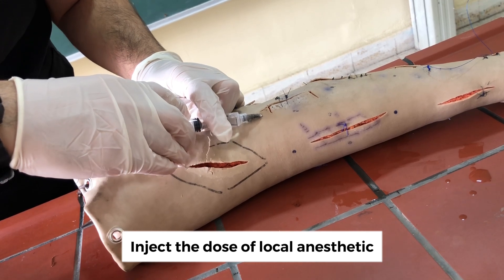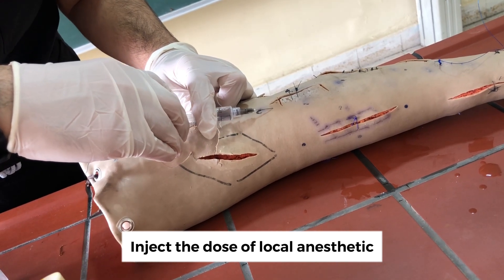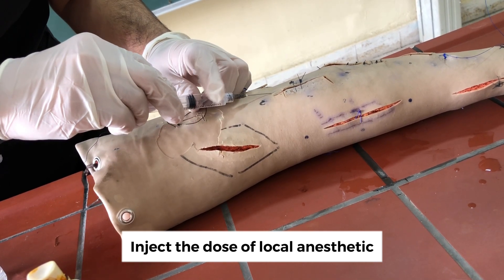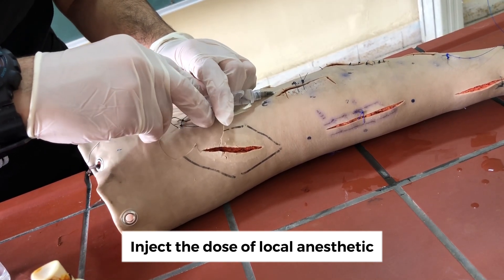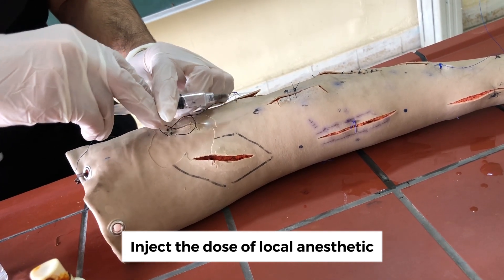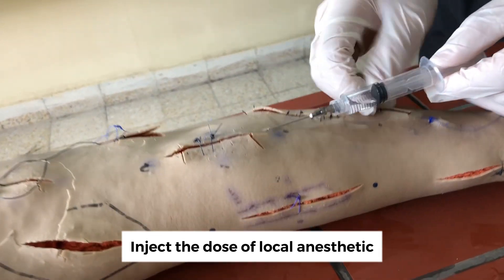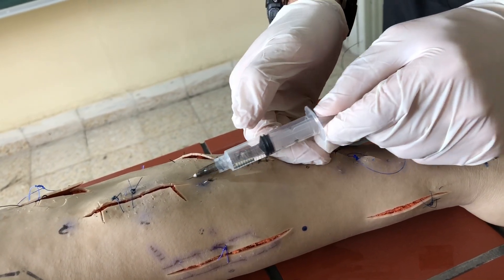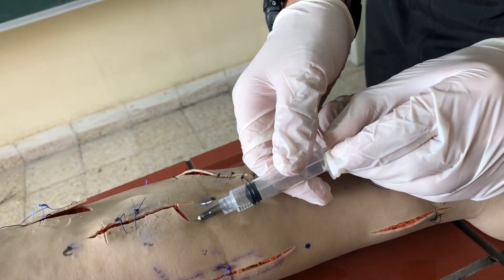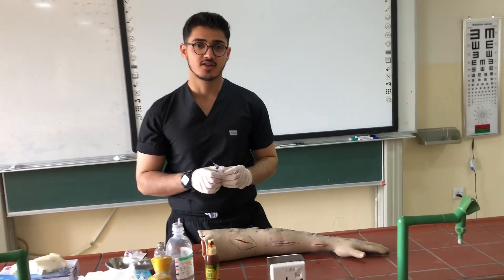We pull back and slowly inject, then pull back and inject again. We repeat the same procedure for the other side — slowly inject, pull back — continuing until the anesthesia starts working.